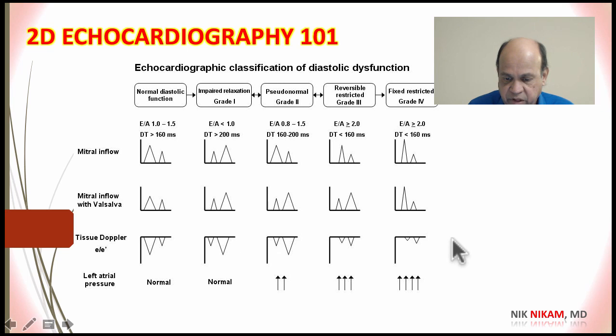And these are some of the points that will help you understand the difference between the degrees of diastolic dysfunction. It may be an important question that might pop up, and you may have to simply memorize these findings, how the mitral inflow Doppler looks at various levels, and how you differentiate grade 1 from grade 3 using the tissue Doppler. All right, that's so much for diastolic dysfunction.